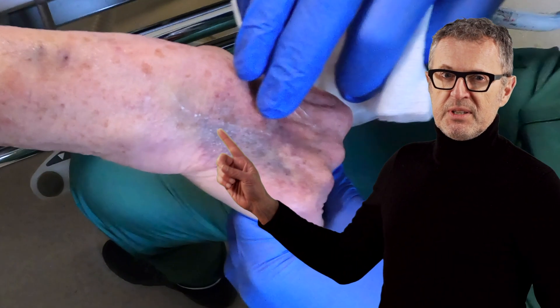This is a 70-year-old woman with a hip fracture. During admission in the emergency room, the nurses tried several times to obtain IV access without success, as you can see on her hand.